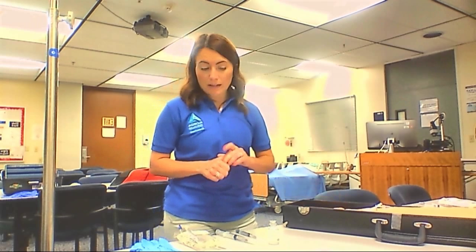I'm in Adult Health 1, Section 11, and I'm going to be doing an IV medication through a mini bag. I've already gotten my basic IV started, so now I'm going to be doing antibiotic infusion through the mini bag. The first thing I'm going to do is implement my standard protocol, ensuring that I have checked the patient's MAR versus the doctor's orders. I am going to identify the patient by two forms of ID, using the patient's date of birth and the patient's name, which I have already done. I've already washed my hands, and now I can begin preparing my procedure.